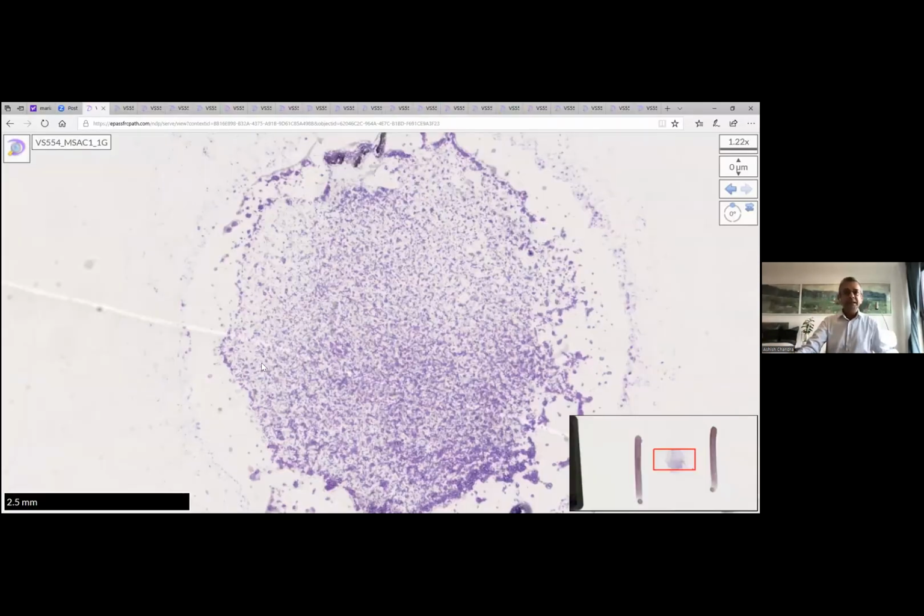Okay, Maria, the stage is yours now. But you're going to run this session slightly differently. So Maria is going to share some scanned slides with you. Again, these are exam standard cases, and we'll have a similar discussion.